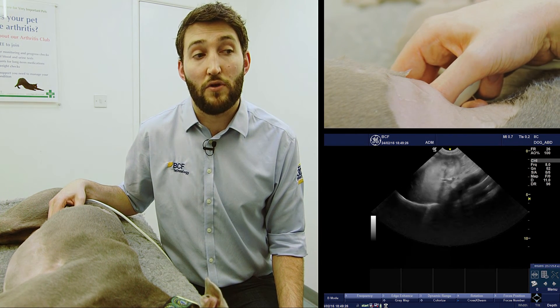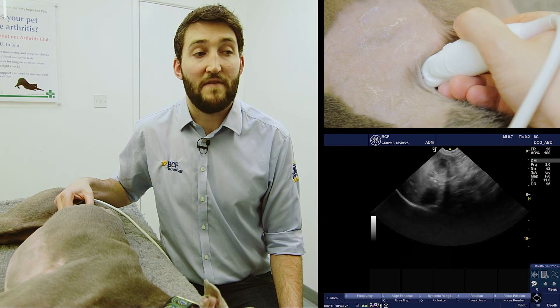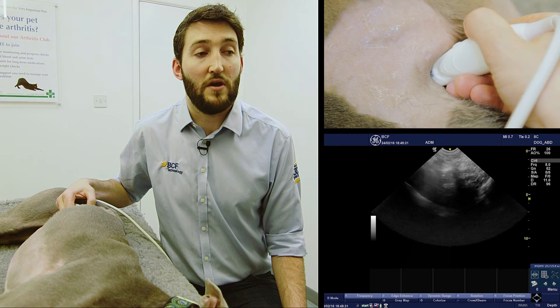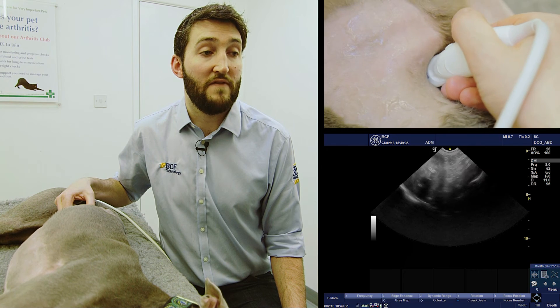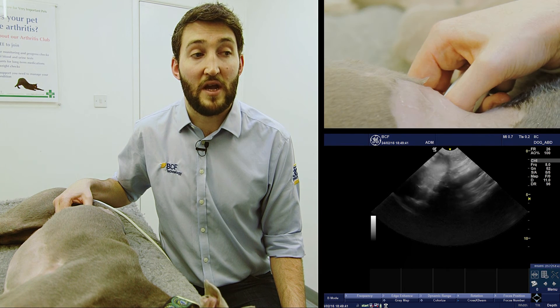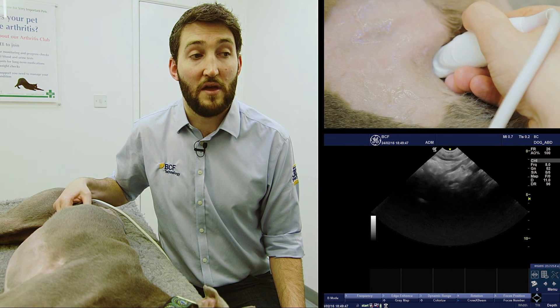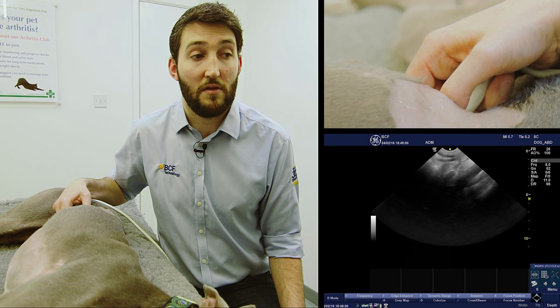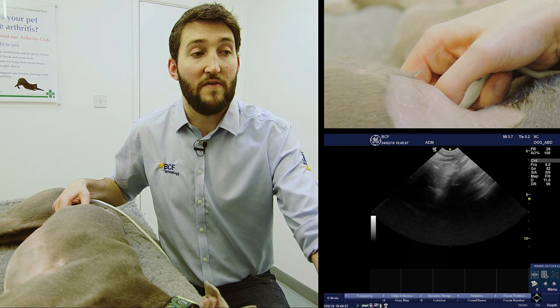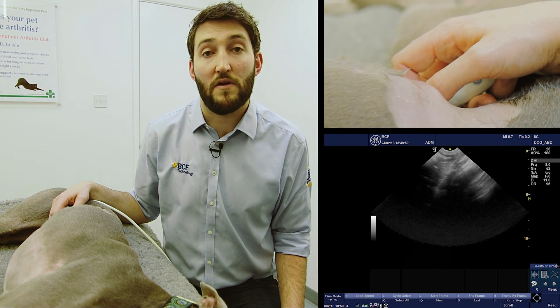If you're really struggling with it, don't worry too much — keep practicing, and try starting with the left one because it's usually the more readily seen of the two. To run through that one more time: start by getting a dorsal plane image of the right kidney, intercostally if necessary, subcostally if you can. Fan dorsally off the dorsal border of the right kidney and back ventrally — the first pulsatile vessel is the aorta. Keep fanning ventrally to pick up the vena cava, then fan back dorsally. Below the intestinal gas there is your right adrenal gland — freeze the image when the intestinal gas has passed to get a clear view.